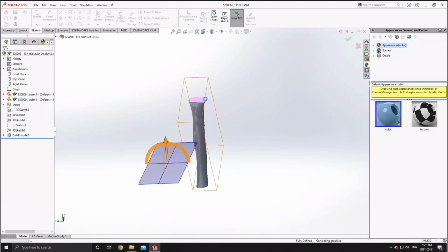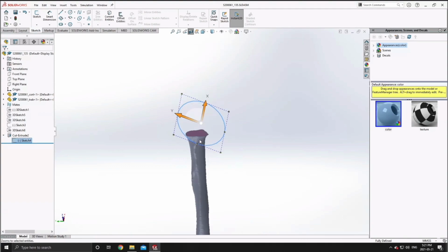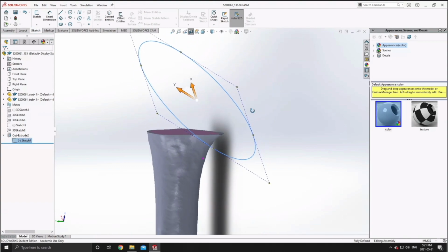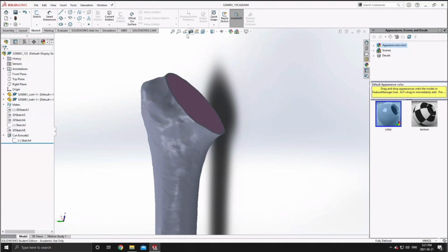Planning ahead here, under the understanding that this model will be used for finite element analysis, I'm simplifying my trabecular and cortical bone models as per the literature to 40 mm and 180 mm distal to the center of the humeral head respectively. This both decreases the size of our part files and provides us with a flat surface on which to impose Encastre boundary conditions in Abaqus.